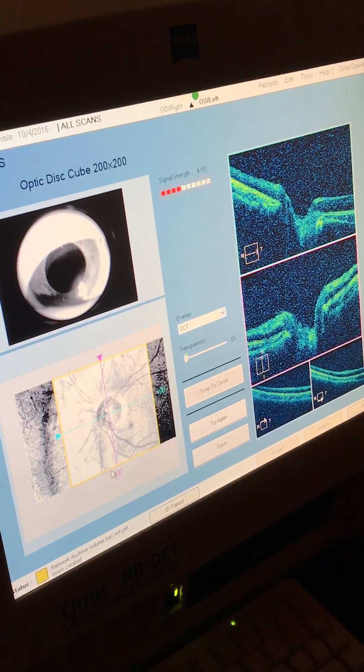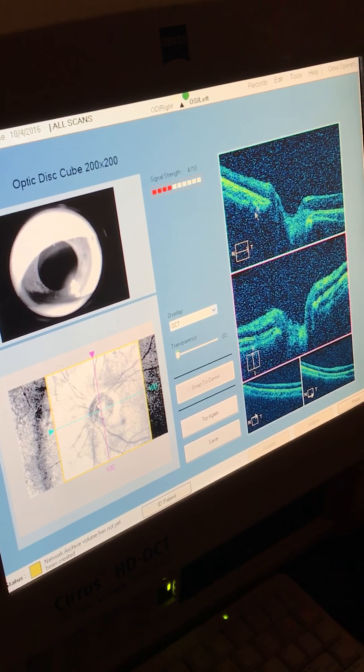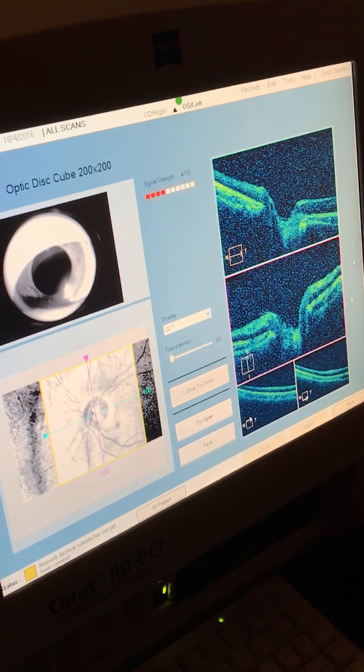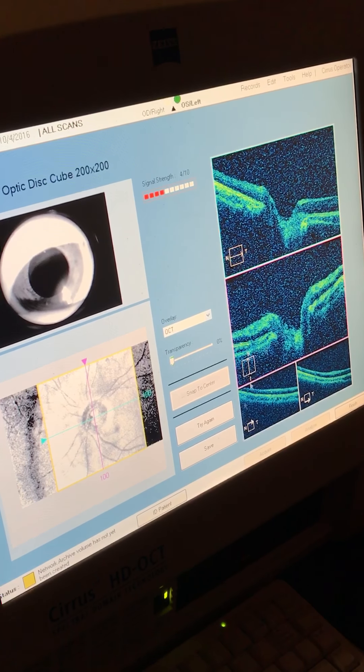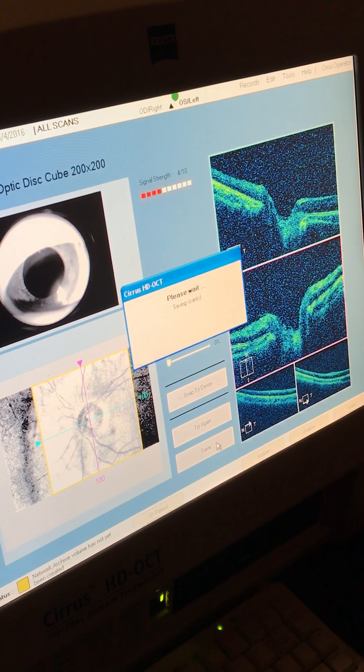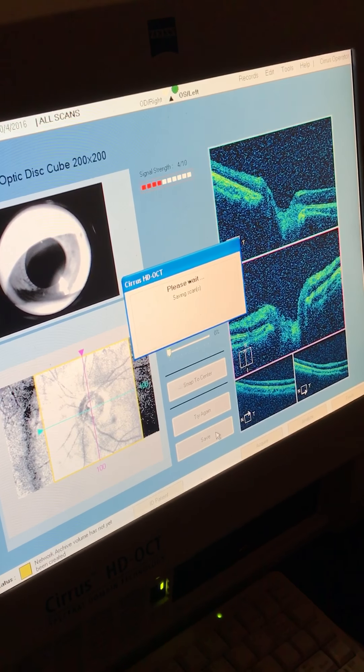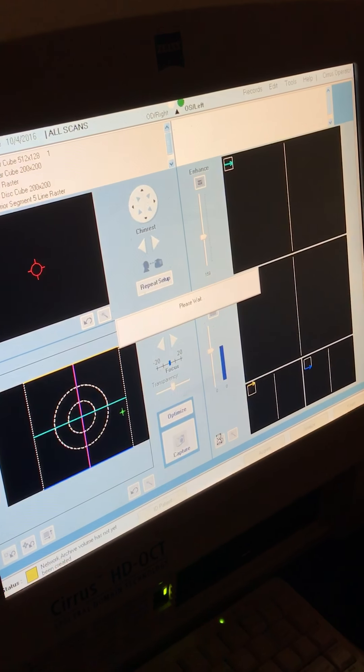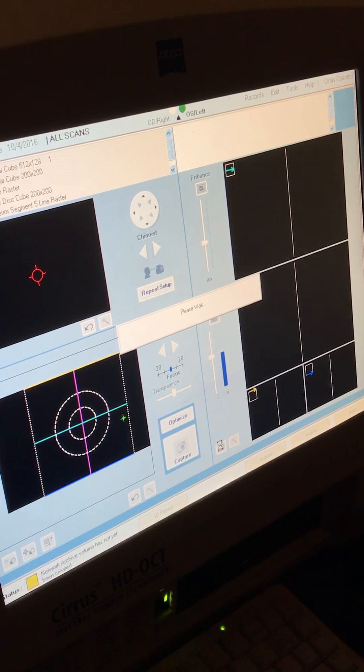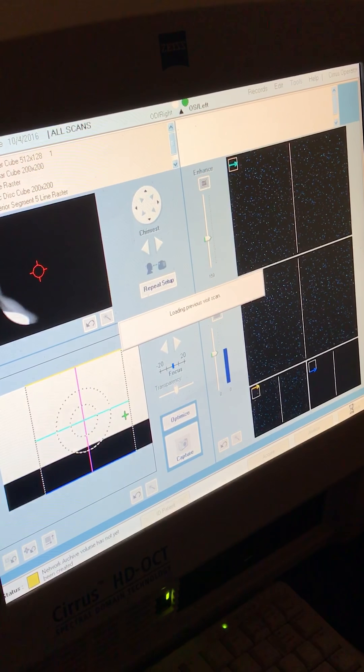Good. So the fundus looks clear. We have all of our images scans here. And we'll hit save. And then once we're done, we'll hit finish down below.